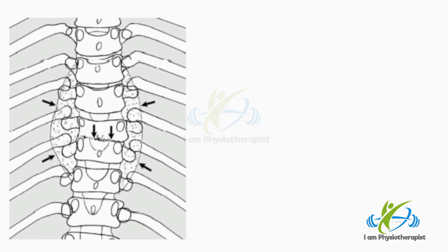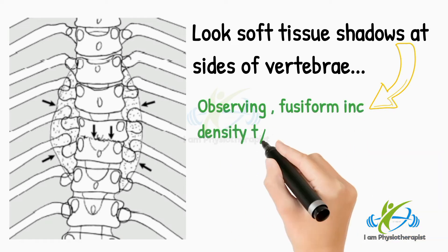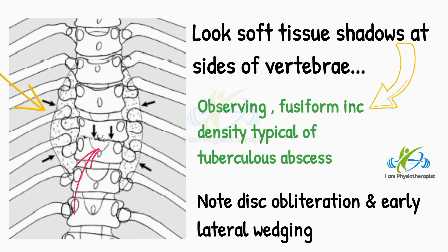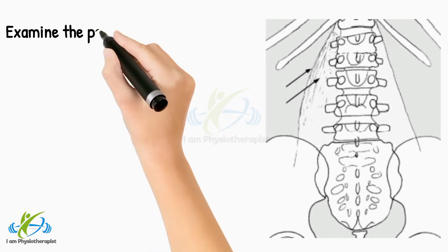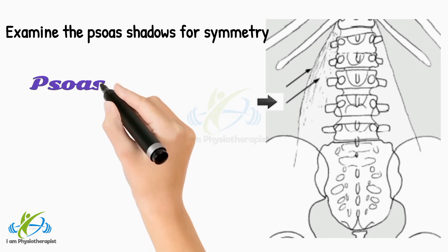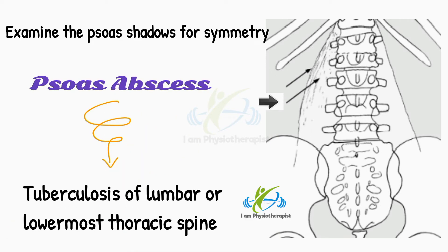Look at the soft tissue shadows at the sides of the vertebrae, observing the fusiform increased density typical of a tuberculous abscess. Note disc obliteration and early lateral wedging. Examine the psoas shadows for symmetry. Lateral displacement of the edge of the shadow and increased density within the area occupied by the psoas suggests a psoas abscess, typically found in tuberculosis of the lumbar or lowermost thoracic spine.